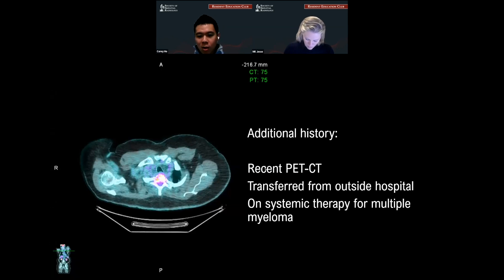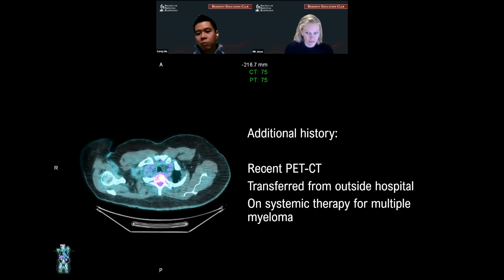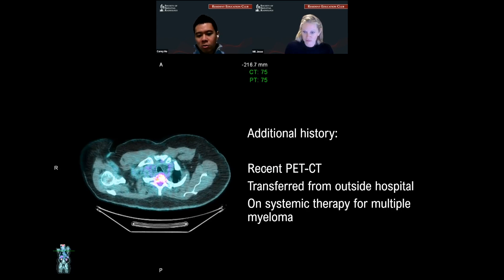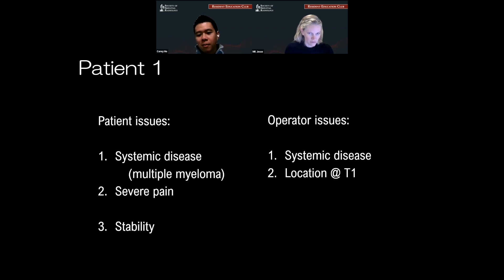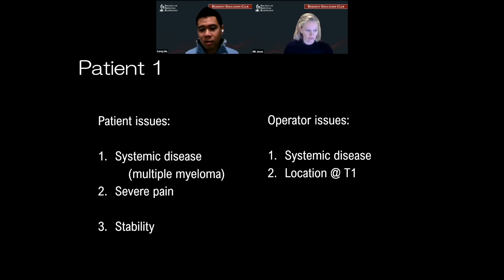The additional history that I withheld was that the patient had a recent PET-CT. They were transferred from an outside facility and are on systemic therapy for multiple myeloma. On the fused PET-CT images, you see hypermetabolic uptake corresponding to the MRI findings. I skipped a layup line for this conference and started with a pretty challenging case. There are a lot of patient and operative issues: the patient has systemic disease — multiple myeloma — severe pain, and stability problems as shown by the vertebral body collapse.